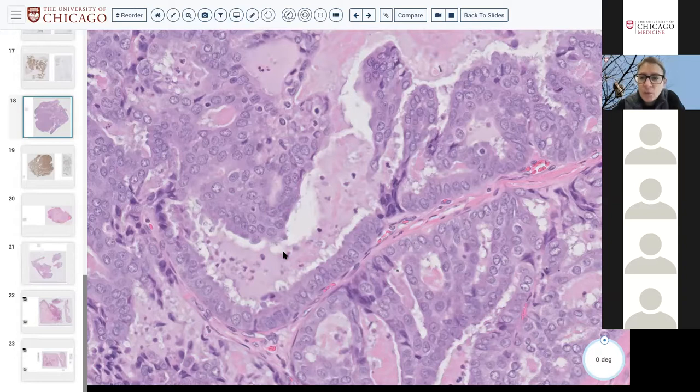Okay, and what material would that be? Anybody? Mucin. Okay. So something that is PAS positive and resistant to diastase. That's why usually two slides are given to you, right? One is PAS without diastase, without amylase. Two is PAS with diastase or with amylase. What does the amylase or the diastase digest out? It digests out glycogen.